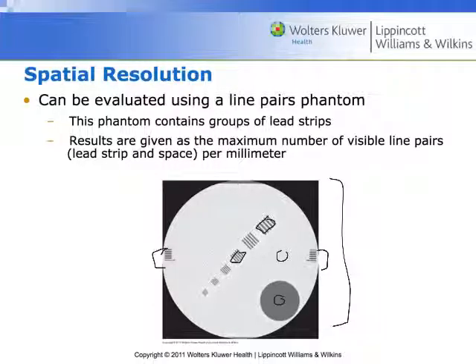Again, before you do any kind of test like this, you want to make sure that this phantom is directly aligned to isocenter. A lot of times, in addition to actually scanning the phantom, you're doing measurements on the lasers to make sure that a laser is here and a laser is here, and the lasers are actually in alignment with the phantom as well.